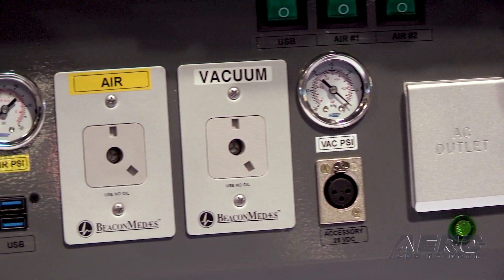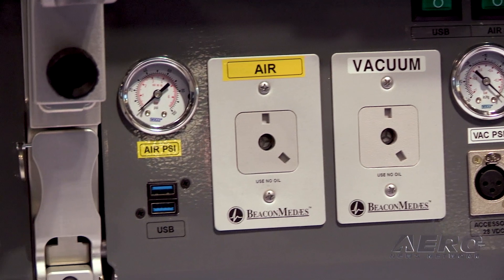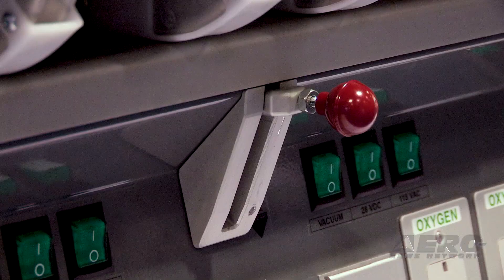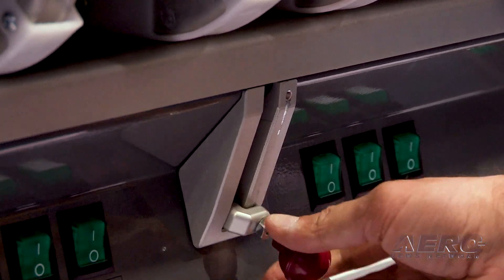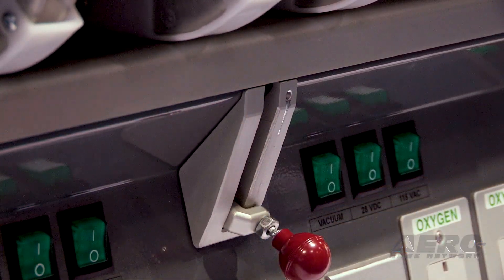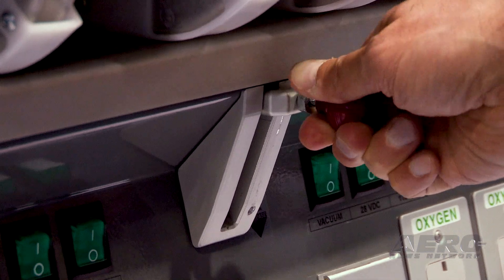You have your patient stretcher with a simple locking mechanism to secure it onto the base. You release this and the stretcher can slide forward and aft out of the aircraft as needed. You also have your standard belting system to hold the patient during the flight.